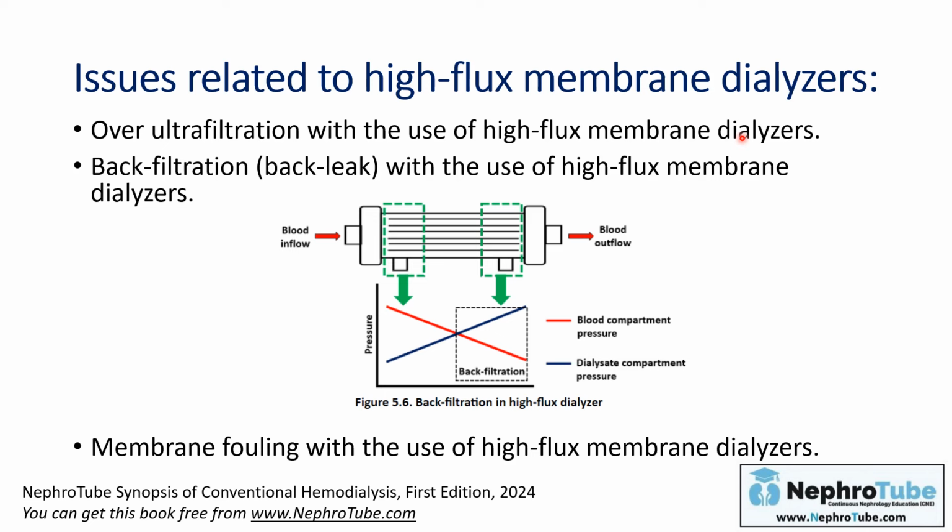And we mentioned that synthetic membranes can absorb some proteins. If you remember, you'll find this in table 5.2 in my book. So if these membranes absorb proteins when they come in contact with blood, the protein absorption will lead to clogging and fouling of the membrane and reduce its performance. So we have to put this also in mind.